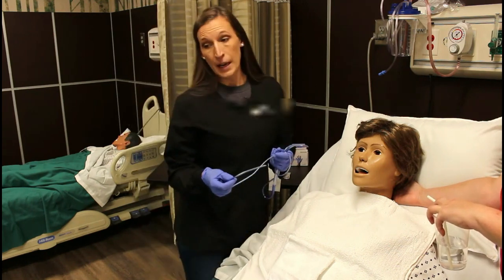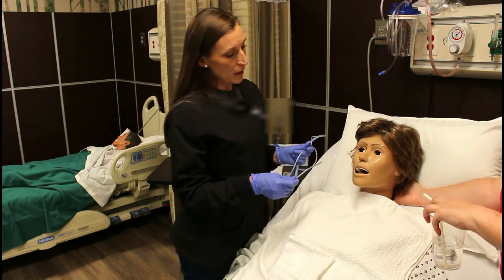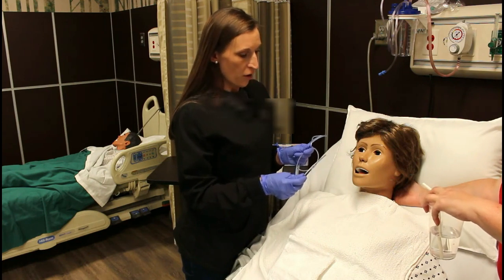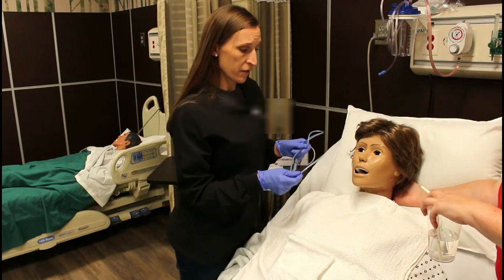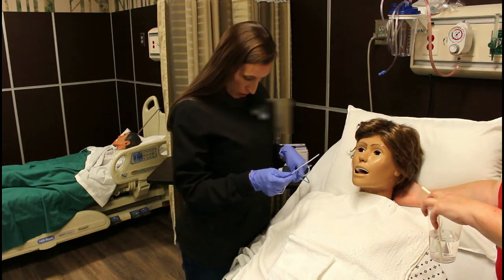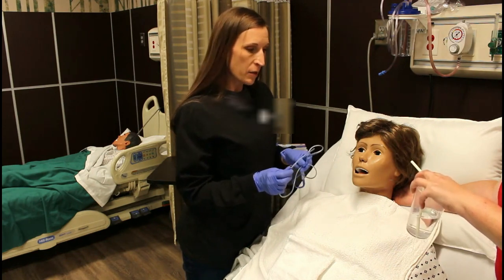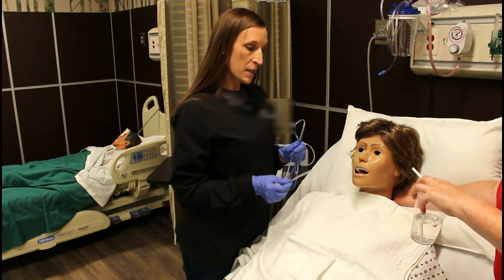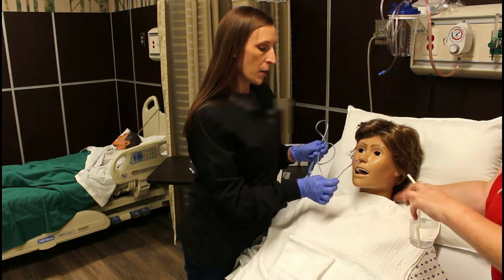Now I'm going to give the patient some instructions. I'm going to place the tube in this side of your nare. When I get to the back of your throat, it's going to make you cough and gag because it is touching the gag reflex. In order to make it go down faster and smoother, I'm going to have you tilt your head down to your chest. I'm going to have you take very small sips of water — don't take big gulps because that can make you nauseous. As you swallow, I'm going to advance the tube. Okay, here we go.